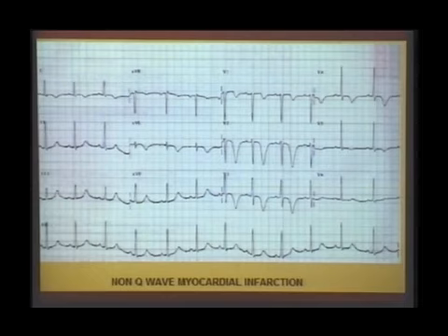For example, in this situation or an ST segment depression situation, if troponin is negative, we call it unstable angina. So that is the difference between unstable angina and non-Q wave MI. To call it an MI, you must demonstrate that the enzymes are positive. The myocardium is damaged, as shown by the elevation of enzyme. So any non-ST elevation ECG change with a troponin positivity is called non-ST elevation MI. With a troponin negative, it is called unstable angina. When the ST elevation is there, it is ST elevation myocardial infarction. So this is the approach, and this is a non-Q wave myocardial infarction.